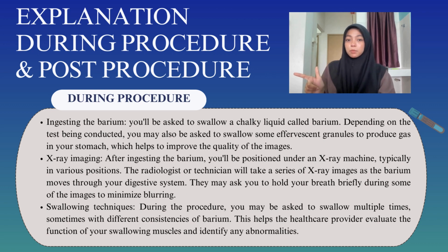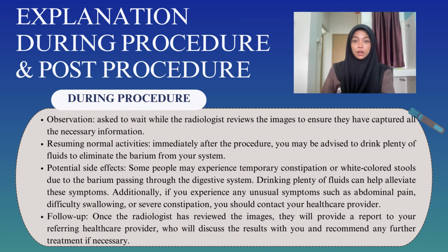X-ray imaging: you will be positioned under an X-ray machine in various positions. The radiologist will take a series of X-ray images as the barium moves through your digestive system. They also may ask you to hold your breath briefly during some of the images to minimize blurring. Lastly, swallowing techniques. During the procedure, the patient may be asked to swallow multiple times, sometimes with different consistencies of the barium. This helps the healthcare provider evaluate the function of your swallowing muscles and identify any abnormalities. That is the during procedure part.